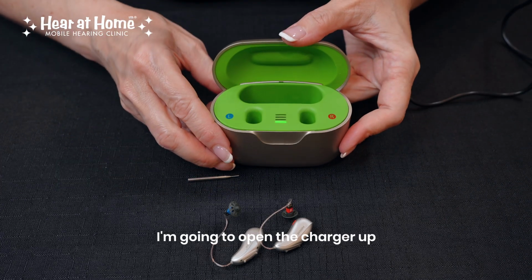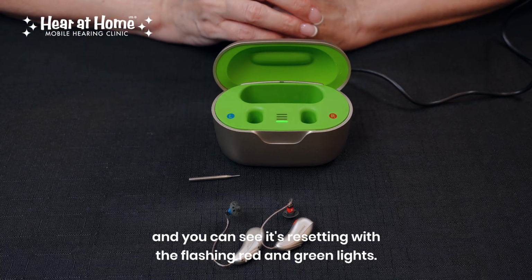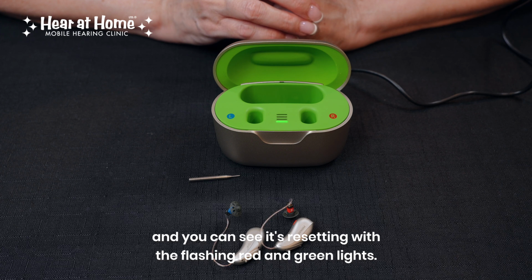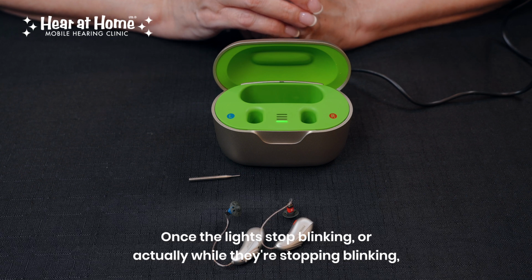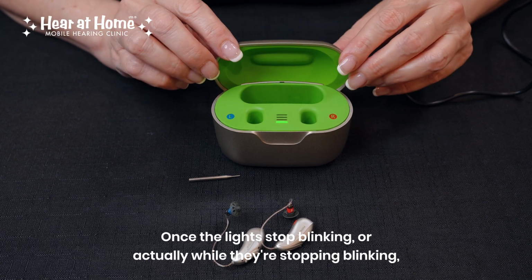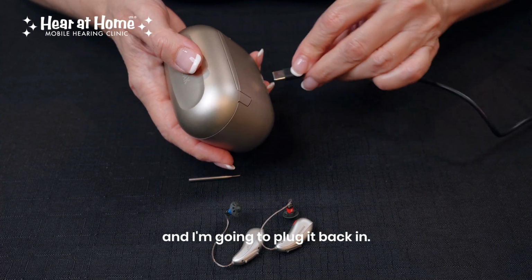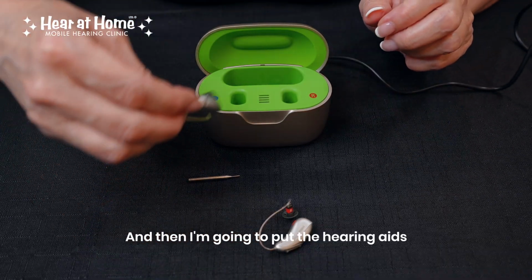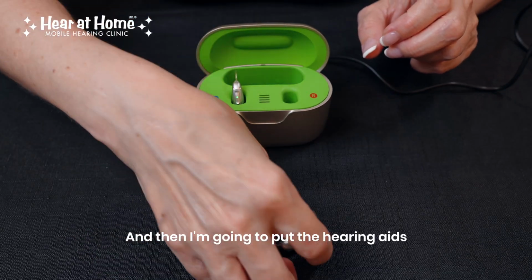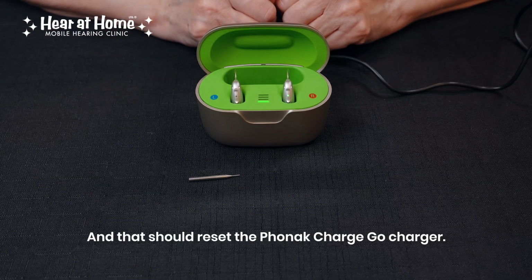I'm going to open the charger up, and you can see it's resetting with the flashing red and green lights. Once the lights stop blinking, or actually while they're stopping blinking, I'm going to unplug the cord and I'm going to plug it back in. And then I'm going to put the hearing aids back in the charger. And that should reset the Phonak Charge Go charger.